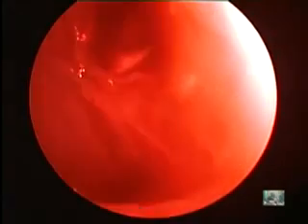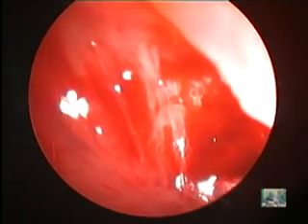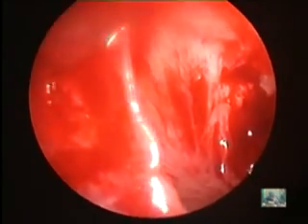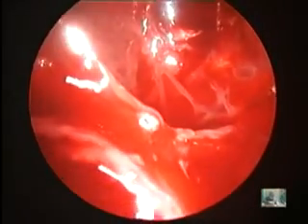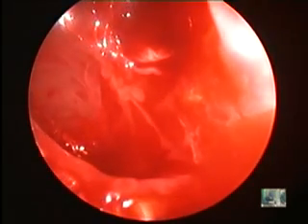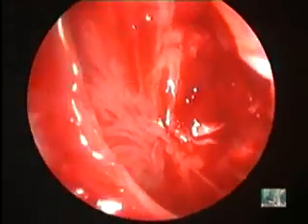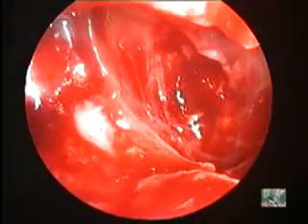This is the maxillary sinus mucosa. You're looking at the roof. Now, I'm looking at the roof and the anterior limit. Yes, it's free. Here is the anterior limit. This is the lateral wall. Now I'm turning inferior. So this is the inferior aspect. It's not a very big maxillary sinus. It looks quite all right.